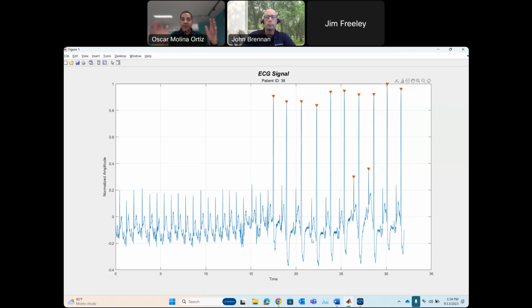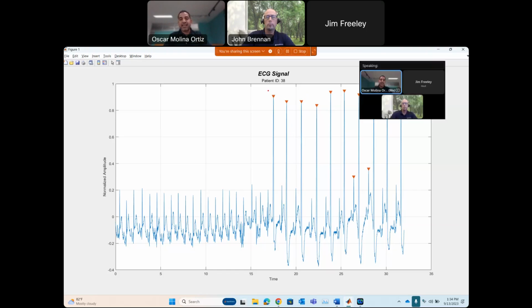So half of the signal has approximately the same min-max level, but the other half of it went all over the board, right? So what the algorithm is reading is the right-hand side part of the signal. Therefore, it errored out because it didn't have enough data to make a conclusion about both the breath rate and the heart rate.